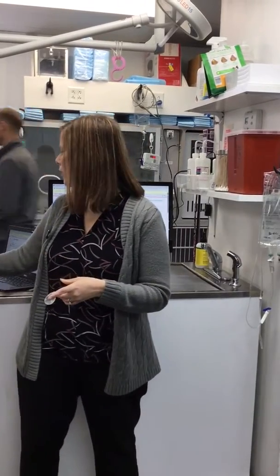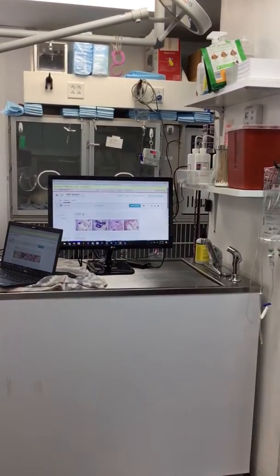If you have a whole blood separator and you have a little bit of blood, let's say on the top or in that edge, what should you do? Wipe it off. Wipe it off, yeah. Okay. All right.